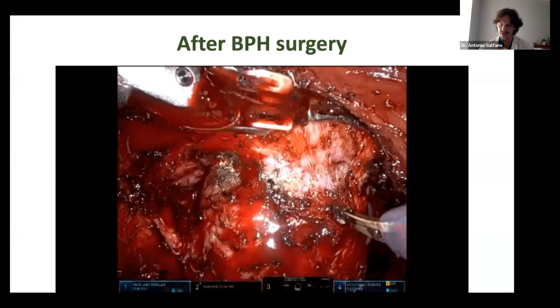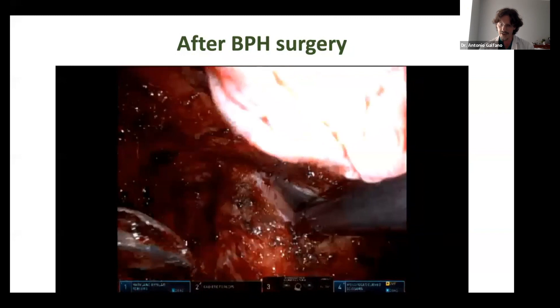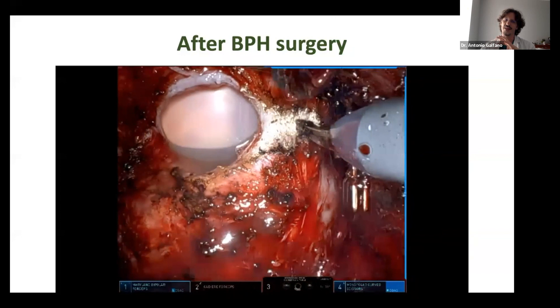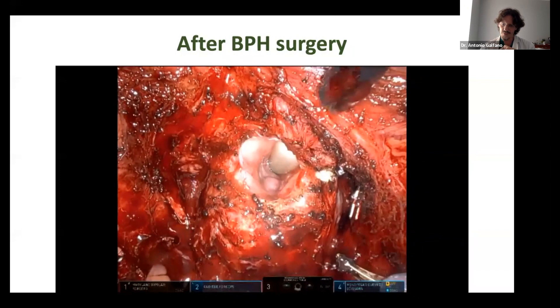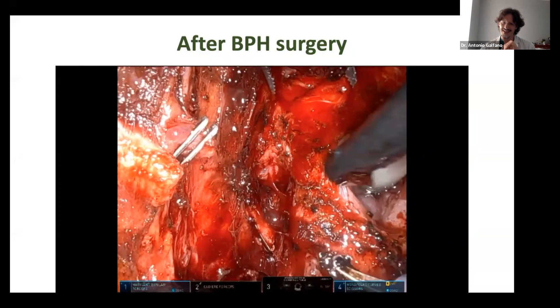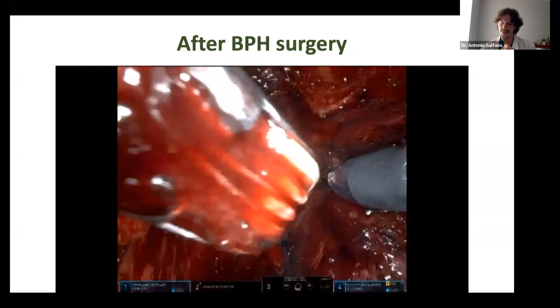Going around, you can see that it's sticky tissue, so you need more energy. But the blunt dissection opened the mucosa because it's the scar of the TURP — most endoscopists resect more on the bladder neck than in the apex. Deflating the balloon allows us to see exactly where we are. We have the posterior shape of the prostate and we are in a good plane with the bladder neck visible. Going from outside to inside is the trick to avoid going inside the prostate — never from inside, always from outside — and following the shape of the prostate allows us to understand exactly our plane.